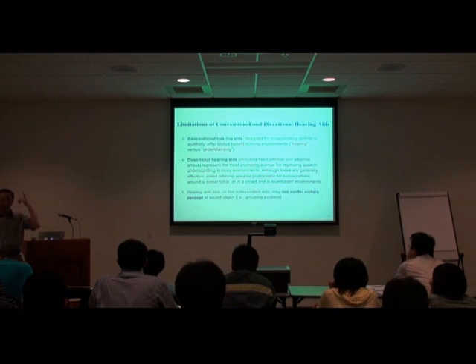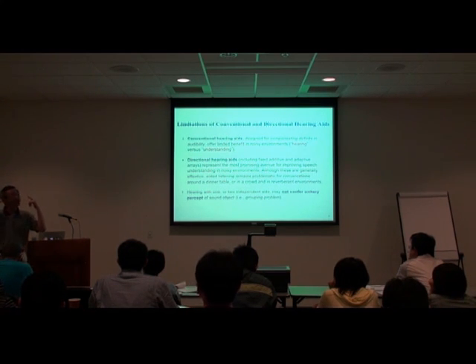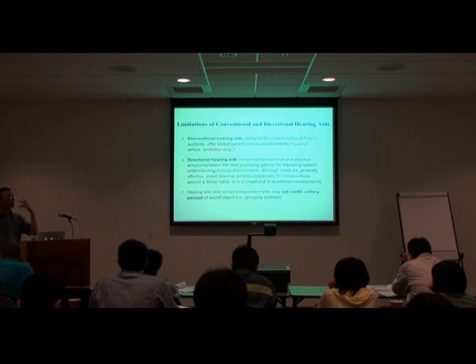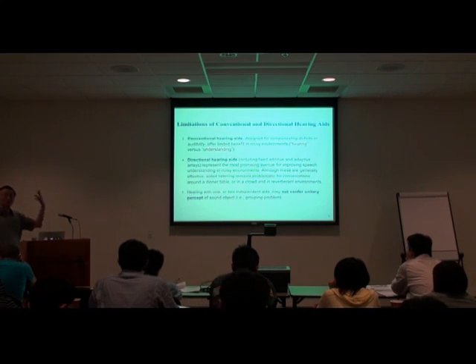Your ear is kind of a non-linear device, right? When the sound in the environment is very intense, you shut down the volume of the sound by contracting the middle ear muscle, in order to protect your eardrum. You contract the middle ear muscle to attenuate the sound entering the ear canal. So it amplifies weak sound, and it weakens the very intense sound.